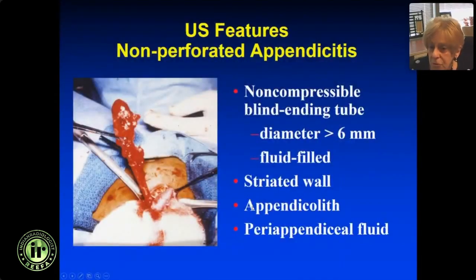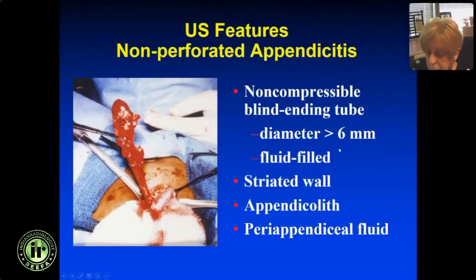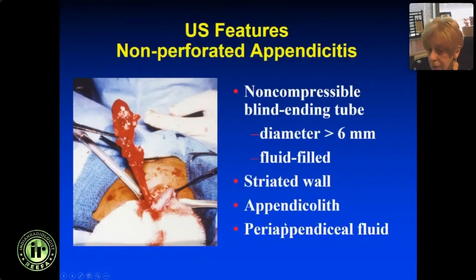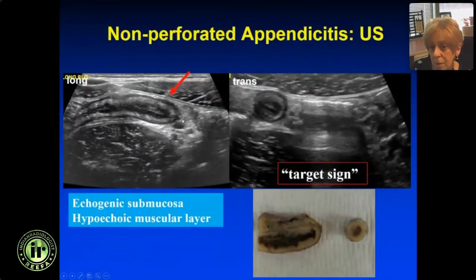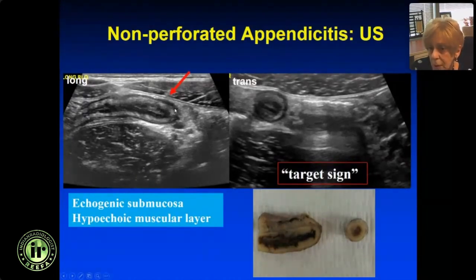Non-perforated appendicitis appears as a blind-ending tube greater than 6 millimeters in diameter. It is fluid-filled, may have air, and if non-perforated, you should see multiple layers of the wall. You may also see fluid around the appendix. Identify the blind end to make sure it's not small bowel. You see the wall is hypoechoic, the echogenic mucosa and submucosa, and a little bit of fluid in the lumen — that's appendicitis. You want to trace the echogenic submucosa around the appendix; if it's absent, the appendix is more likely ischemic or going to perforate. On transverse view it's a target sign.